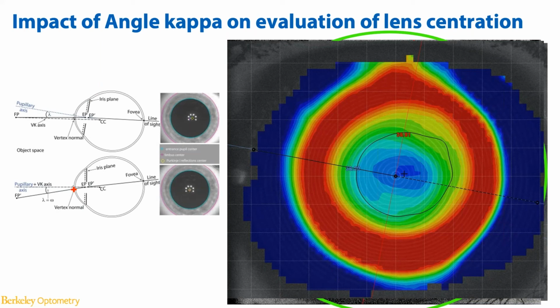What I'm looking at is I want the central area to have some significant asphericity, meaning only the very center part of the cornea is being flattened the most, and beyond that, I want to see some undercorrection. So even within this treatment area, we're getting a lot of positive spherical aberration. And also in terms of the paracentral steepening, there are actually at least 3 components at play.